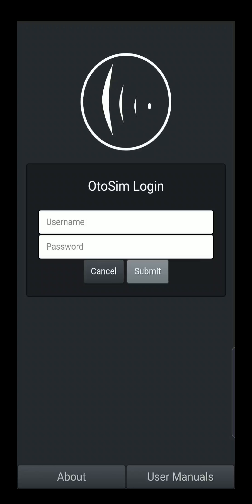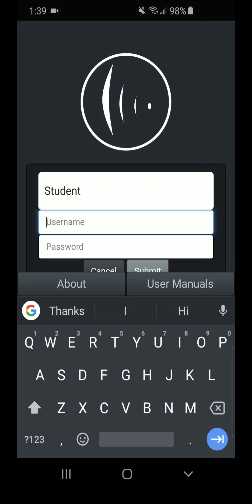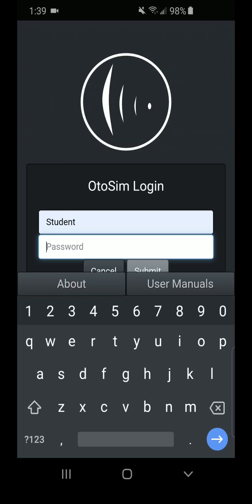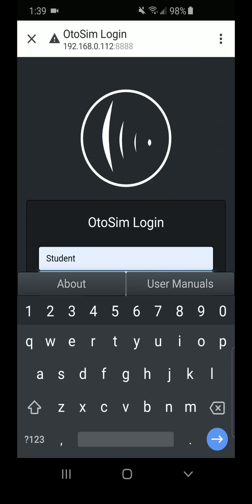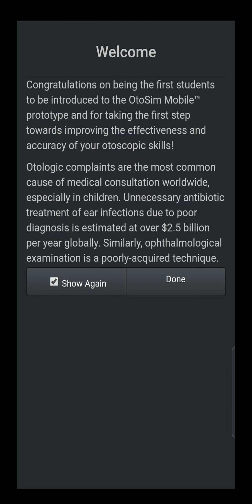As you notice now, the navigation bars have been removed and the application appears in full screen view. We will now put in our username and password. In this scenario, we've given the username as 'student' and a password. Yours will be unique to yourself. We'll save this password, and this will bring us to the next screen.